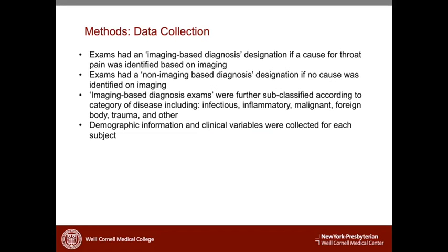If a cause of throat pain was identifiable based on imaging, an exam received the designation of having an imaging-based diagnosis. If no cause of throat pain was identifiable, an exam received the designation of having a non-imaging based diagnosis.